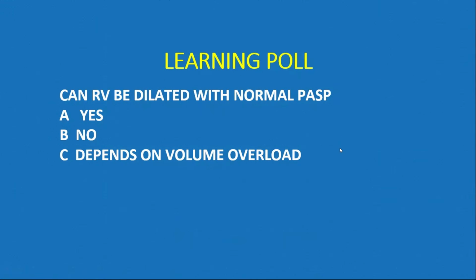Okay, so let me answer. A lot of people have chatted. Now, ma'am, suddenly a lot of responses are coming. Ma'am has asked a very relevant question: RV is dilated, but PA pressures are not raised. Then there has to be something; we have to search for the cause. That was the main thing. Dr. Rahul will highlight and emphasize more on that, and we keep this question still pending. But yes, you're right that the answer is yes.